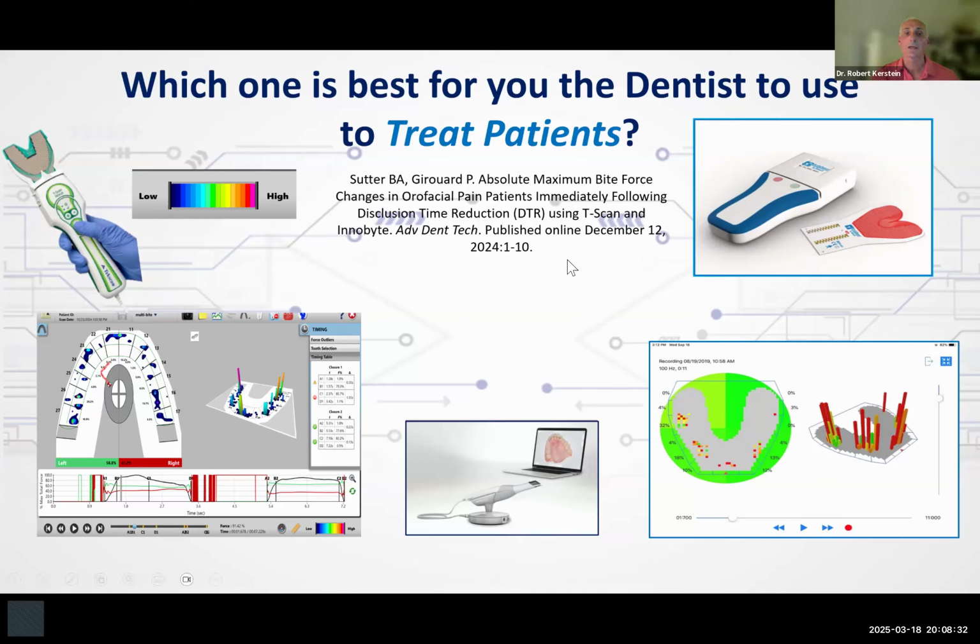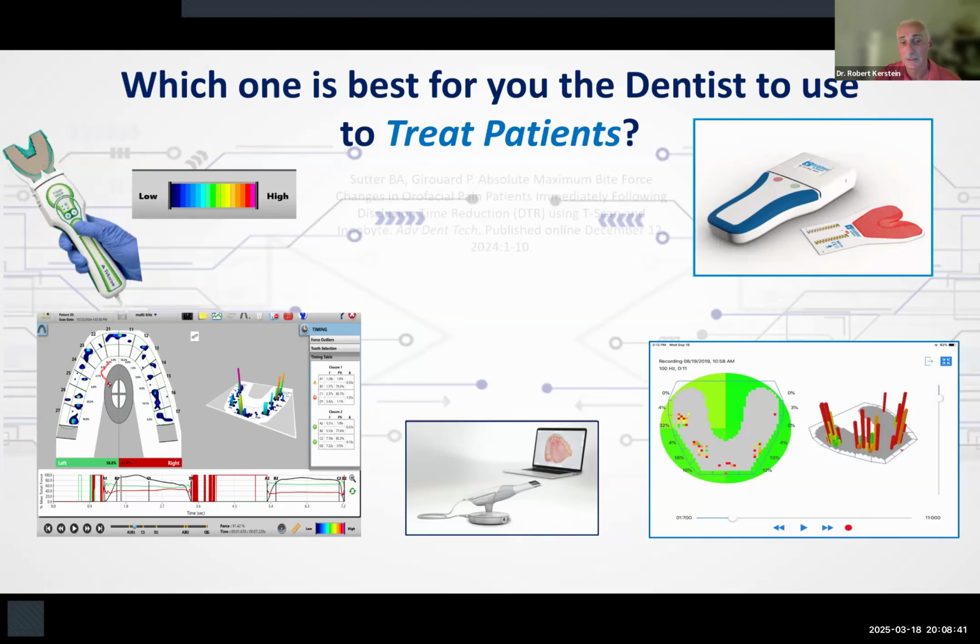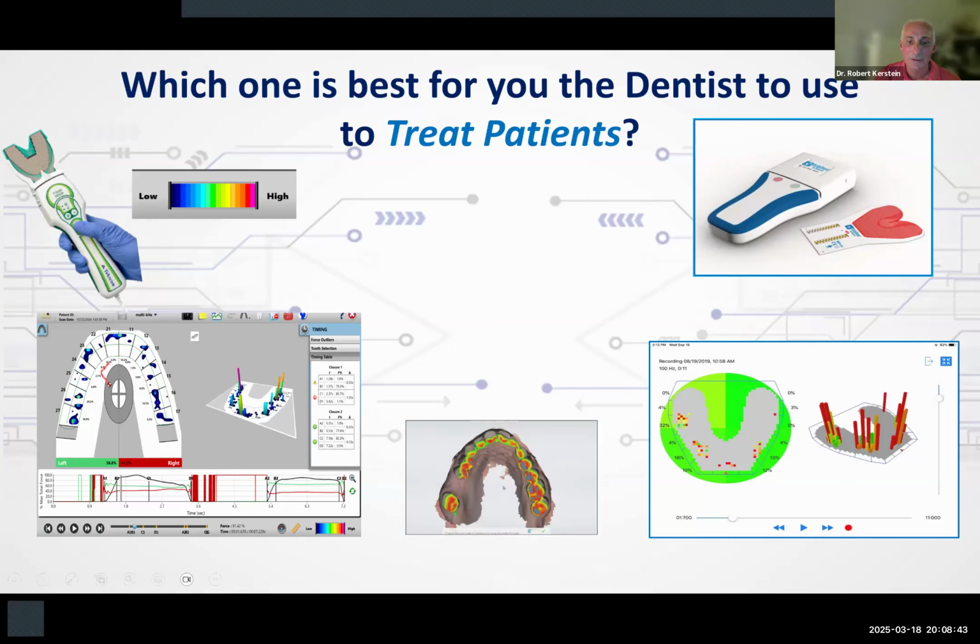It can't treat the occlusion, tell you which contact is a problem or what part of the mouth is a problem. So InnoBite really isn't for treating patients. Then we have scanners. Well, scanners, these occlusograms, you can't treat patients with either. They may help you design crowns, they may help you design restorations, but you're going to learn a little bit more about scanners.